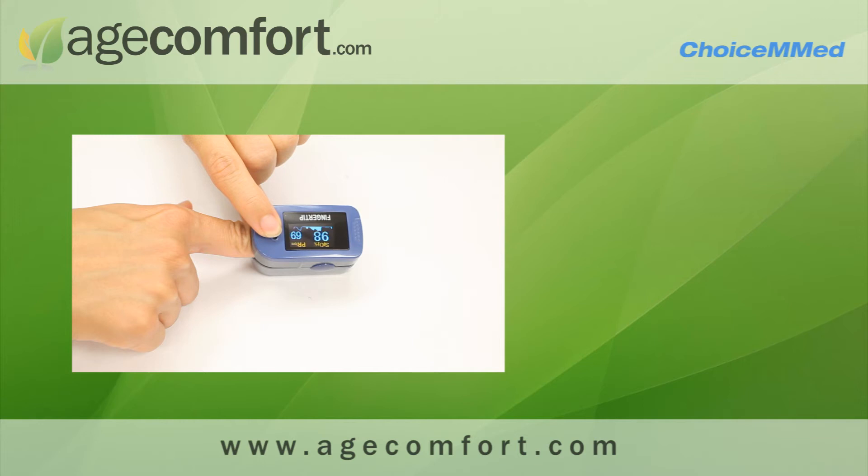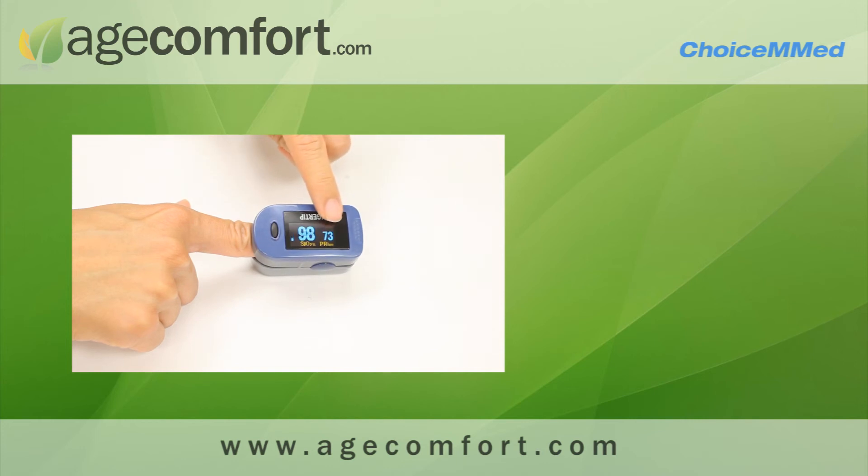You'll notice that there are many variations of how the screen can be read — upside down or right side up. This number here is your SpO2 reading, which is typically above 95%.